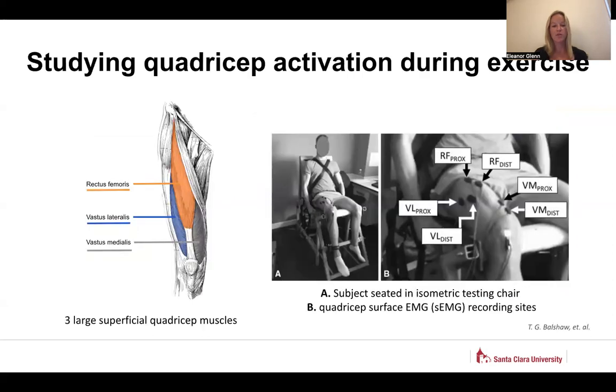We validated our solution with carefully designed experiments that assessed both accuracy and precision. We used surface electromyography to look at the activation levels of the individual muscles that contribute to force output and determine if a force measurement is an accurate representation of strength. SEMG is a non-invasive, simple method for recording the electrical activity of the motor unit. Muscle activity levels are measured with SEMG sensors placed on large superficial muscles.